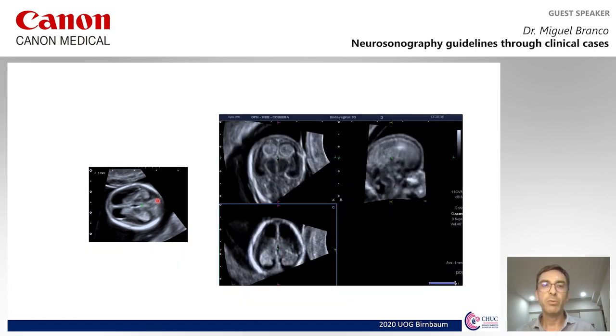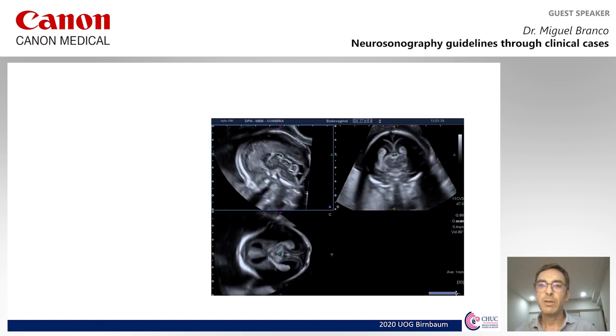Until recently, we thought that this fluid-filled cavity was the third ventricle. But as we can see here in this multiplanar reconstruction, the dot of reference is far too high to be the third ventricle, and it is the cavum velum interpositum. And that is clearly visible at 17 weeks, here the cavum velum interpositum and here the corpus callosum.